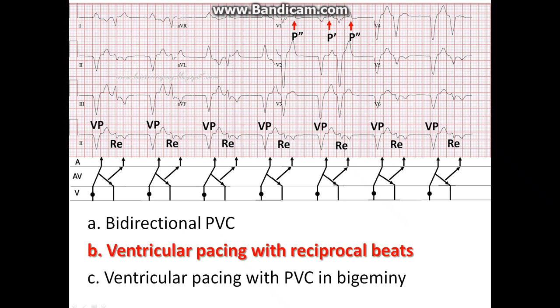The first wide QRS beat is a ventricular pace beat — tiny pacer spikes are best seen in long lead 2. A retrograde P wave is seen after the ventricular pace beat at an RP interval of about 260 milliseconds. A wide QRS beat, or reciprocal beat, or echo beat then follows, with a PR interval of about 280 milliseconds.